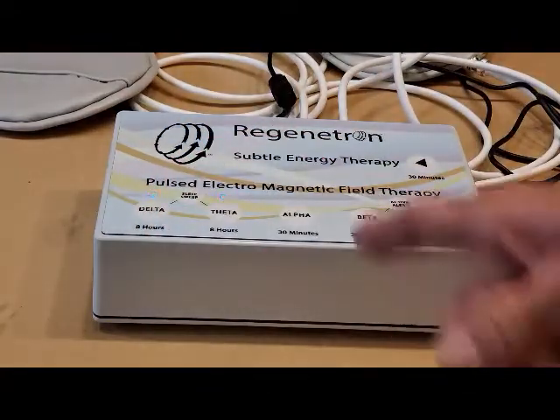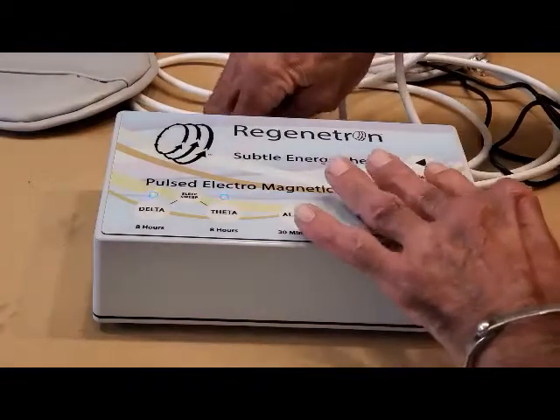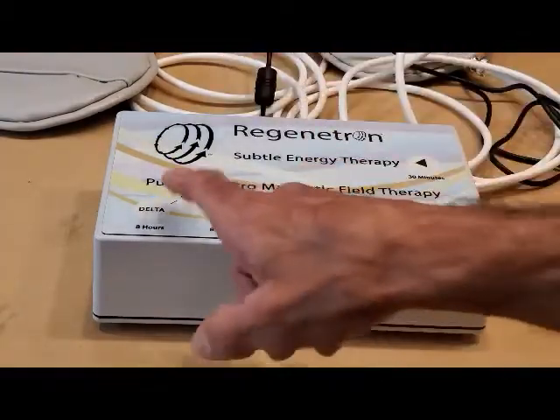It'll beep a number of times. You'll know that it happened when the unit flashes. Then you need to go ahead and unplug your device and plug it back in, and it should be ready for use.